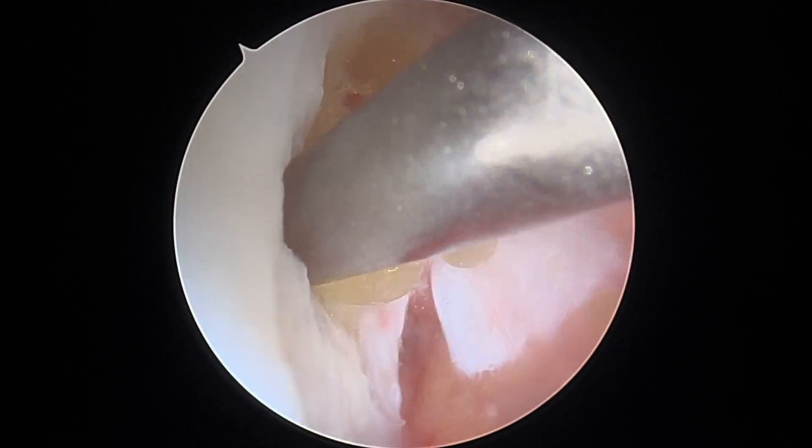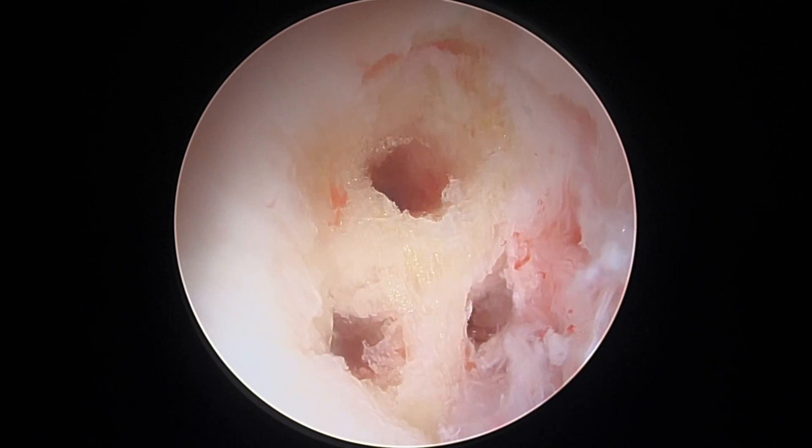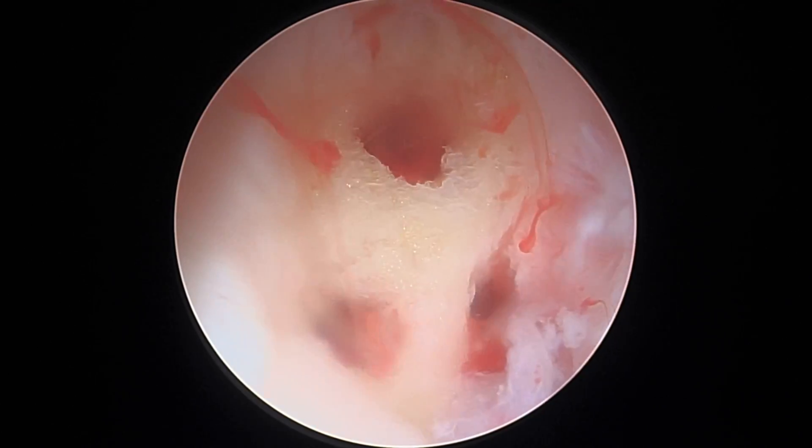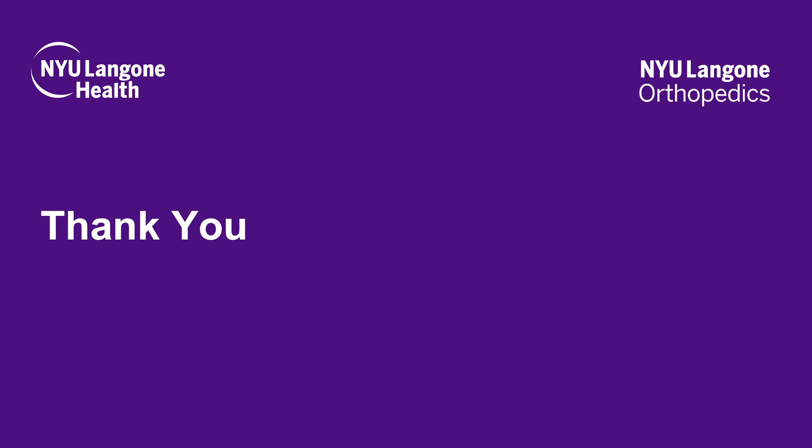We then perform a microfracture technique to allow mesenchymal cells to help with the healing. Thank you.